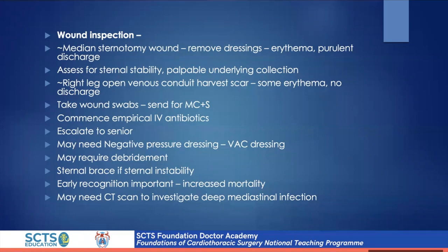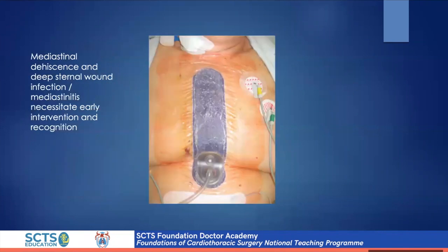If there's a worry that this patient has a deep infection, we should escalate for further imaging with a CT scan to check for any mediastinal collection, mediastinitis, deep mediastinal infections. But these things can happen. It's important as SHOs on the ward that we recognize and are able to escalate these as soon as possible. And I've just shown a picture here of what the VAC dressing is.